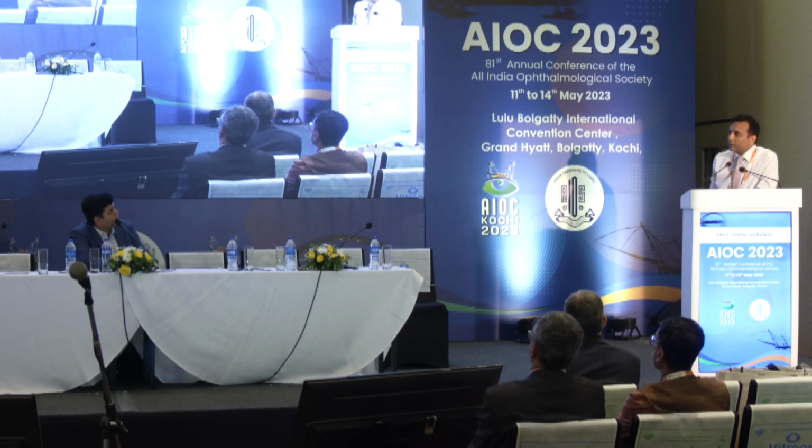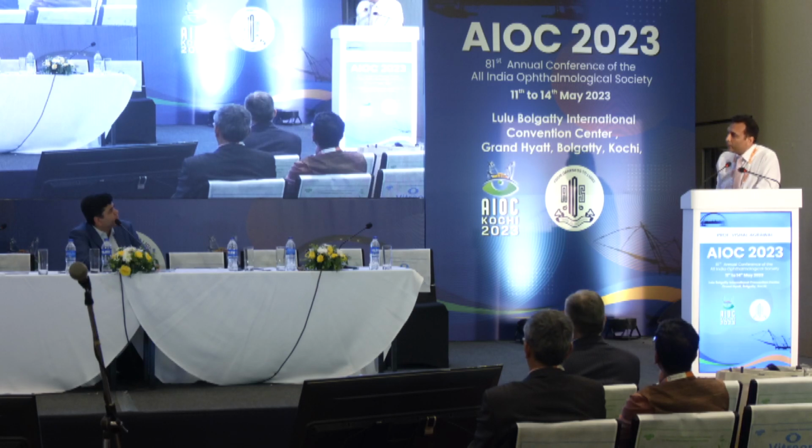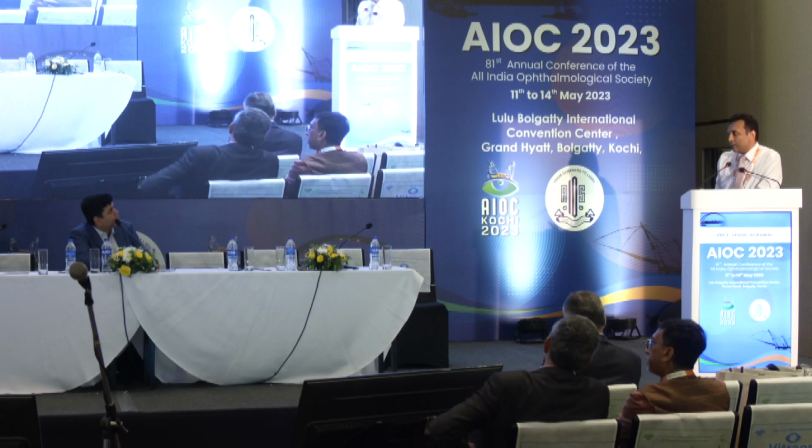These are complex surgeries. And how many months do you follow up? Because many times it takes time for the schisis to regress, or because your pictures show that in 15 days it has become flat, but in a few patients it takes longer. In foveoschisis, if you don't have any other hole and you do the inverted ILM flap in these cases, around 6 weeks or 8 weeks, the fluid resorbs, even if the RPE is very unhealthy in these cases, as it is.